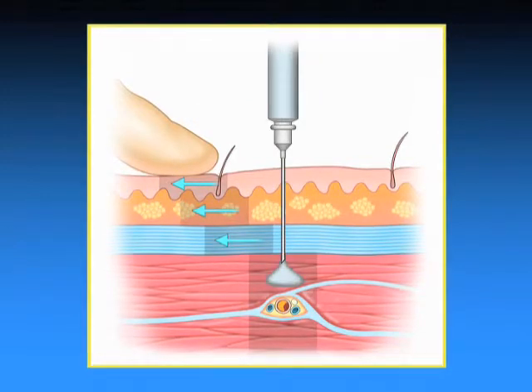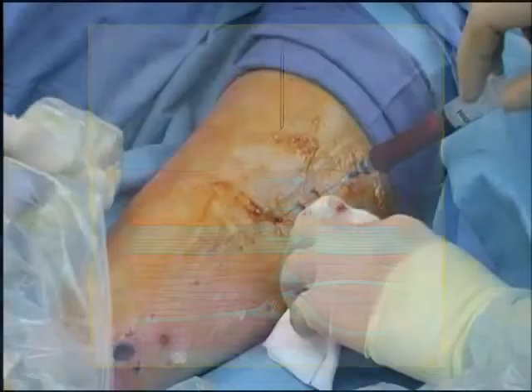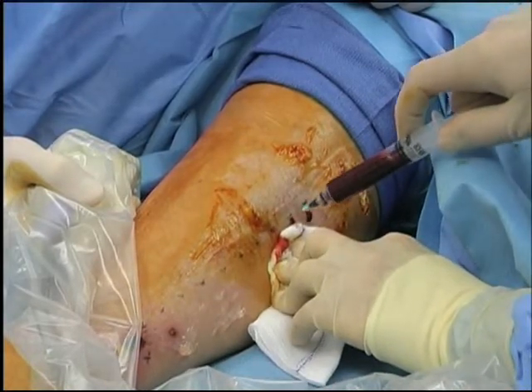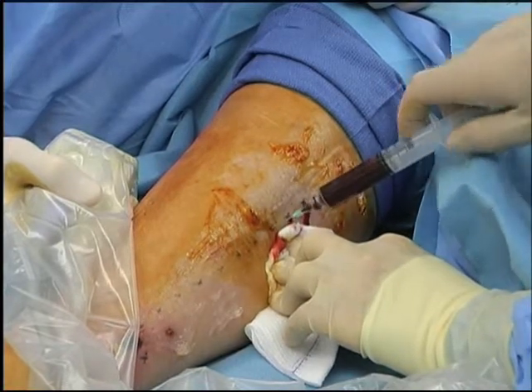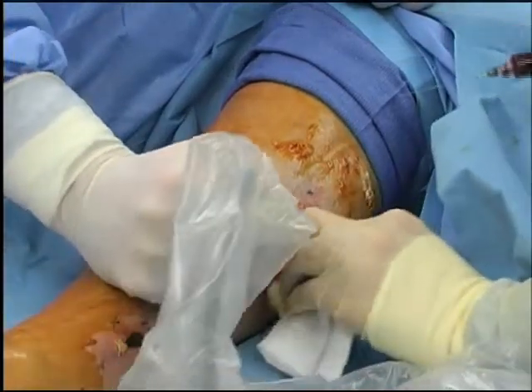Insert the needle at a 90-degree angle at the site where you initially placed your finger. Inject 1 milliliter of volume and withdraw the needle. Remove your finger from the skin surface, allowing the layers to return to their normal positions. The needle track is now broken at the junction of each tissue layer, trapping the injectate in the muscle. While inserting the needle, draw back 0.5 to 1.0 milliliters on the syringe to prevent intravascular injection. Injections are ideally placed within 1 centimeter of the targeted vascular bed.